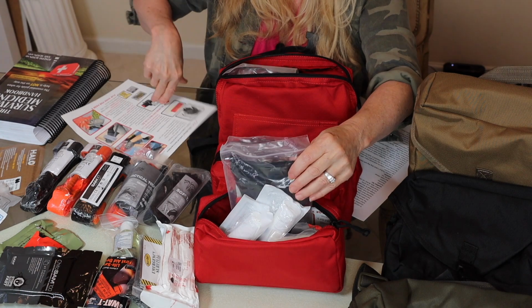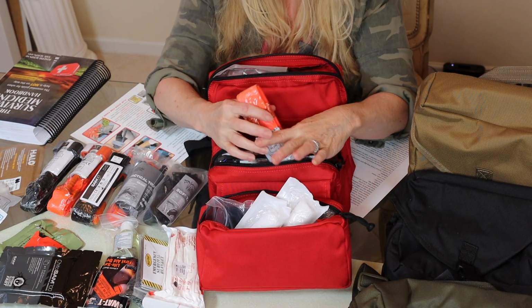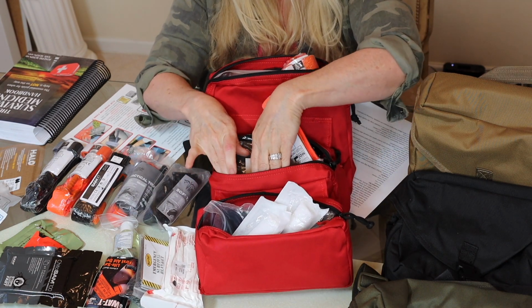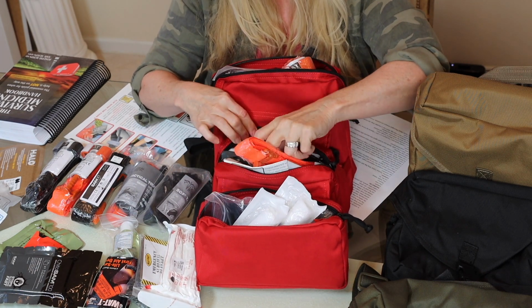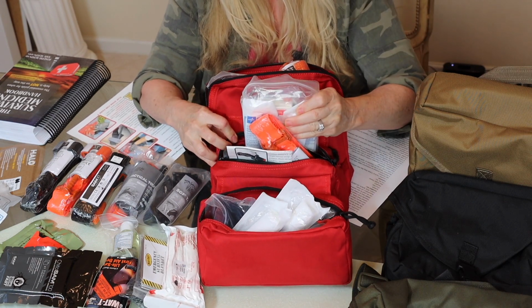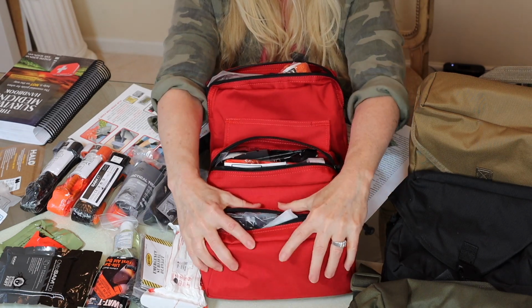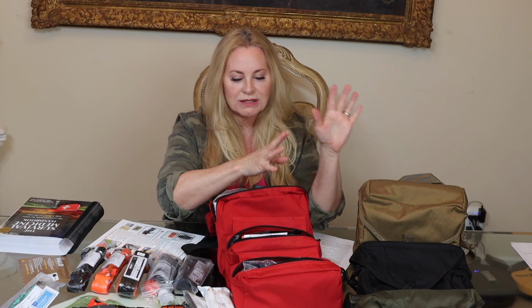In the second compartment, you're going to have the same deal. You're going to have a military tourniquet this time, just like the third compartment. Your hemostatic gauze, Israeli dressing. Again, the instructions based on the tourniquet that you have chosen. In the pack with all the extra supplies, each one of these sections is meant for a bleeding injury. If you have 3 different patients, you have 3 different compartments to help stop bleeding. The supplies can be taken to each patient depending on where they're located. If they're all near each other, just divide it up.